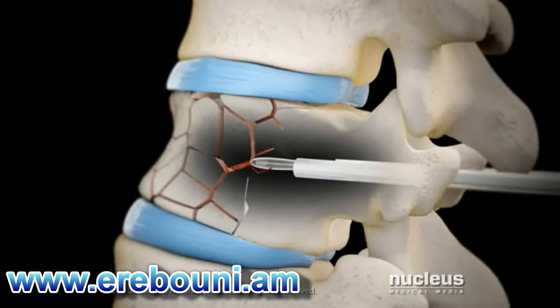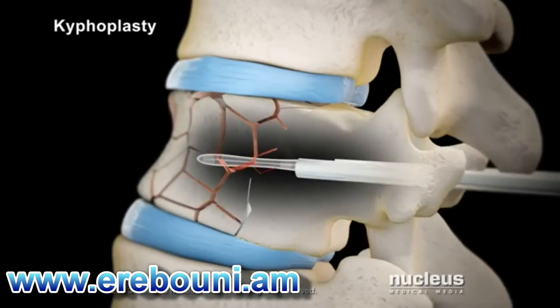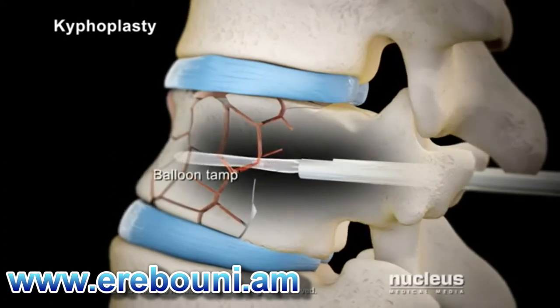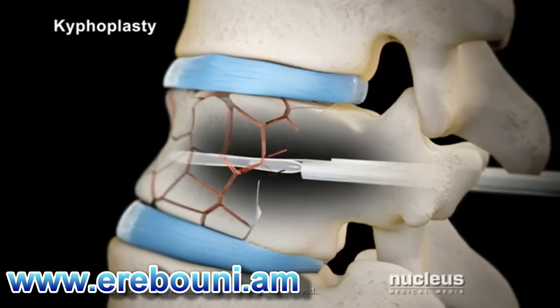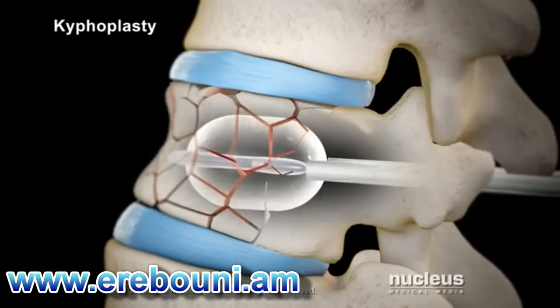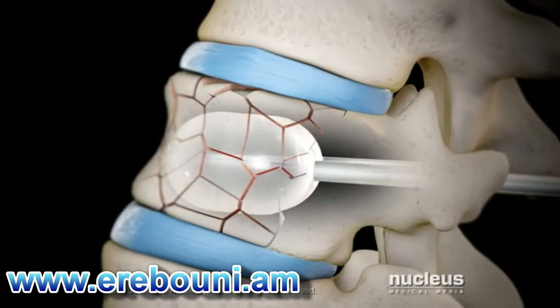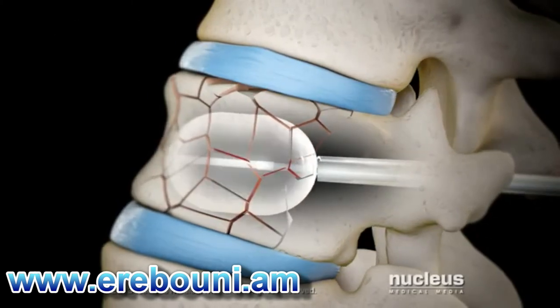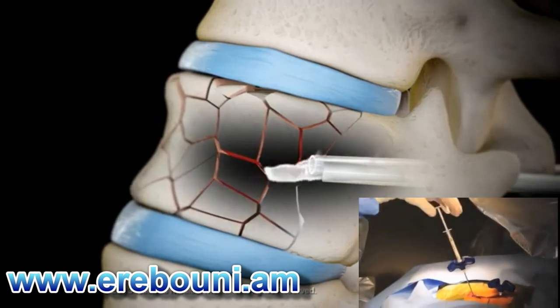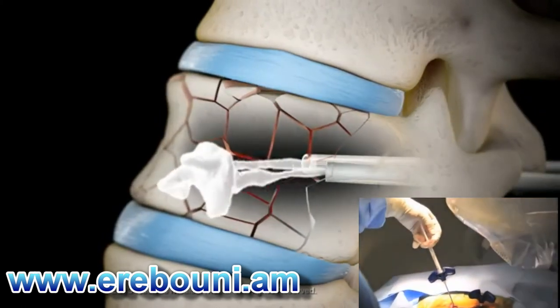If you are having a kyphoplasty procedure, your doctor will first insert a balloon tamp through each cannula before injecting the cement. The balloon on the tip of this device will be inflated to restore the height of your vertebral body. After deflating and removing the balloon tamp, your doctor will fill the space created by the balloon with bone cement.